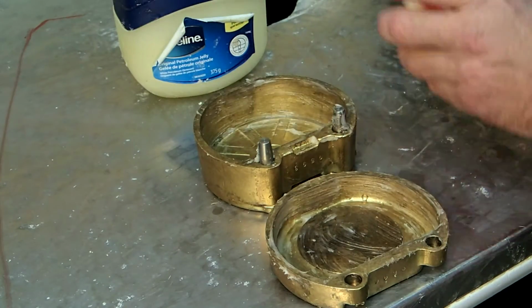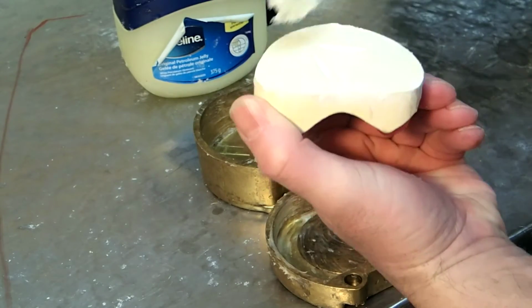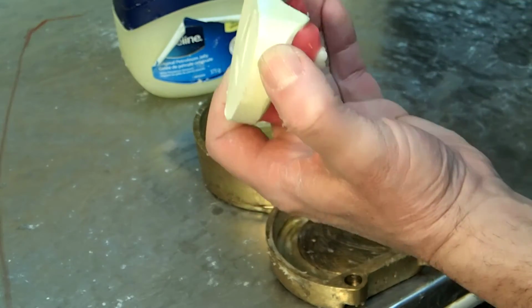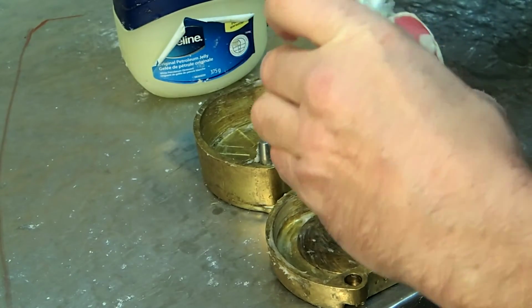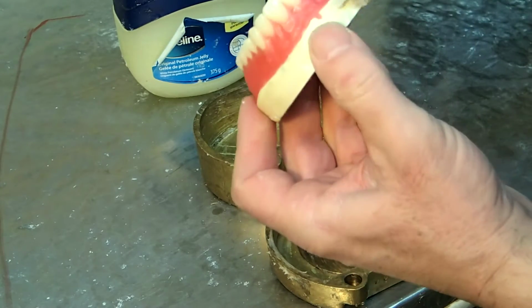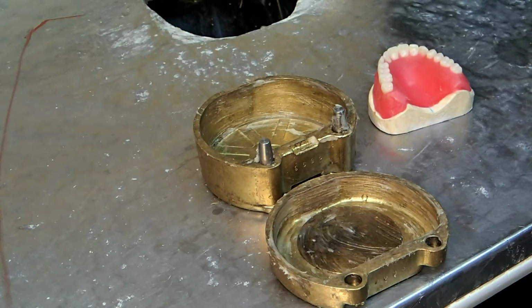For the denture, what I'm going to do is put Vaseline on all of the exposed stone. So every bit of stone that I can see, I'm going to put Vaseline on. I don't need it to be a thick layer. All I need to do is get a little bit of Vaseline on there. This is going to separate our model from our flasking stone. Okay, so that's now separated.